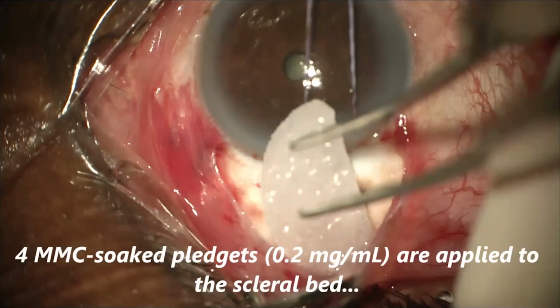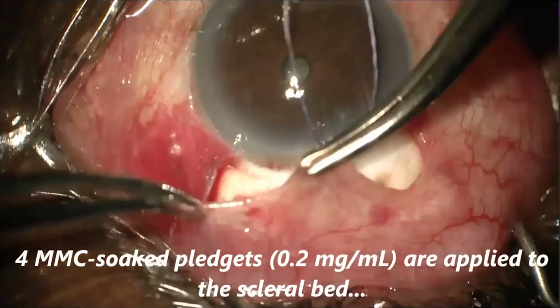You may end up injecting mitomycin C instead, but for most of us in the US, when we were doing the initial pivotal trial, we used MMC soaked pledgets. Always want to be careful to avoid having the mitomycin C touch the leading edge of your conjunctiva. This is an area that you don't want to be too avascular.